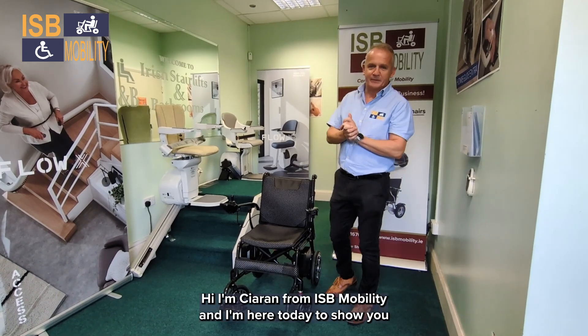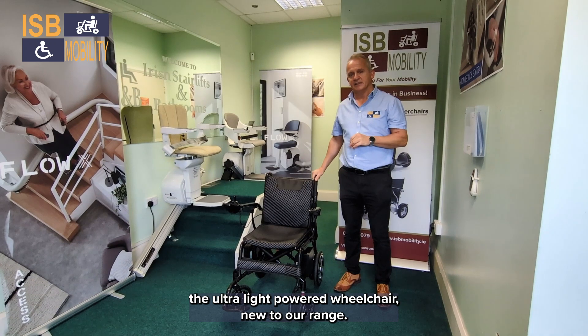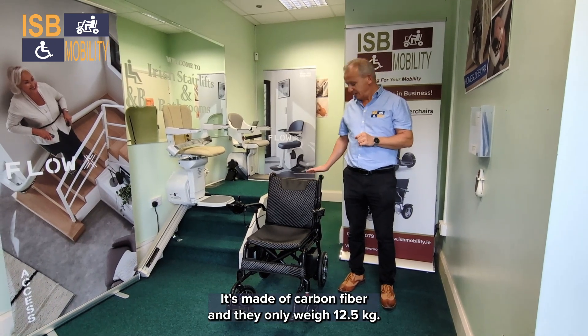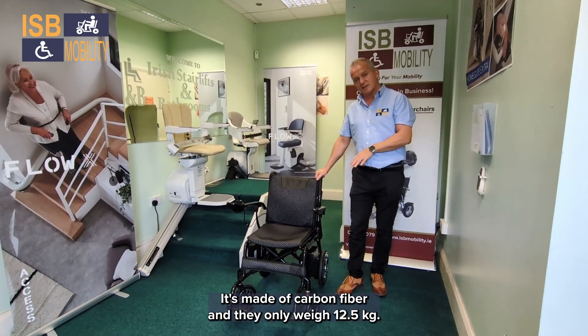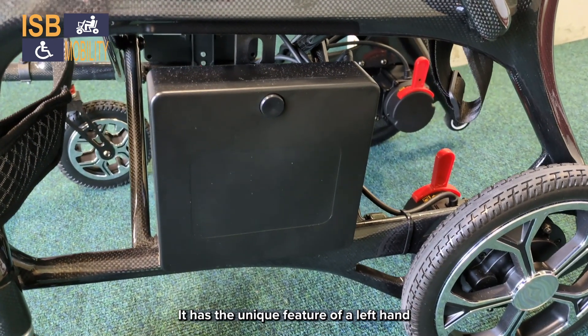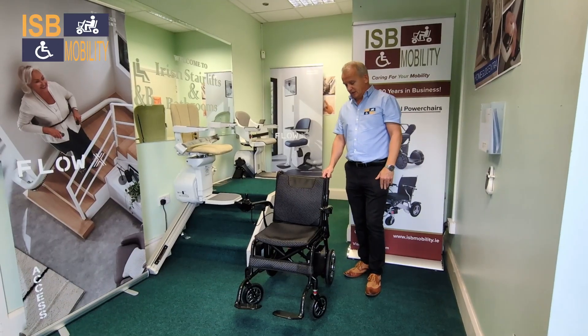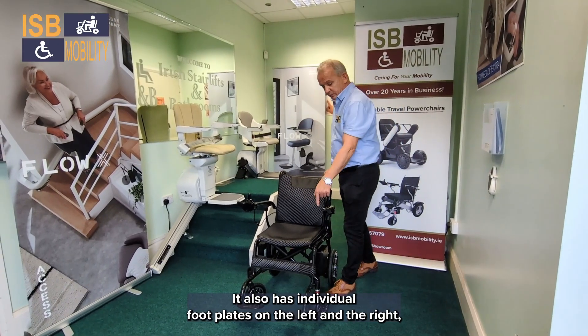Hi, I'm Ciaran from ISB Mobility and I'm here today to show you the ultra-light powered wheelchair, new to our range. It's made of carbon fiber and only weighs 12.5 kg. It has the unique feature of a left-hand and a right-hand lithium battery, which is airline friendly.